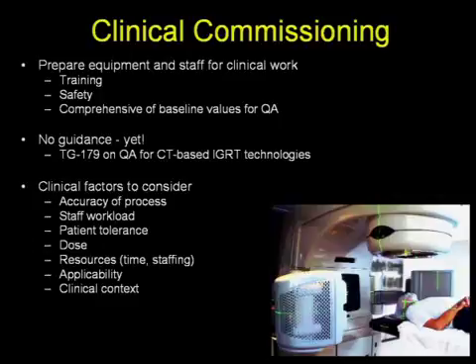So all this to say that the clinical commissioning should be guided by the clinical context, and to have the multidisciplinary team define what are the goals that are to be achieved using IGRT technologies.